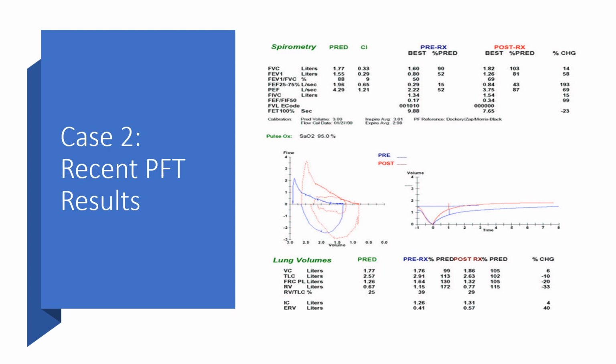So again, not surprisingly, you have this patient whose spirometry, before bronchodilator, has a 90-something percent predicted, and afterwards it's 103. That's the forced vital capacity. It's a 14% change. A good rule of thumb would be 15%. I've seen some of the books say as low as 10% would be a significant change. Some of the books said 20. So in that mid-teen range or greater would be a significant response to bronchodilator.